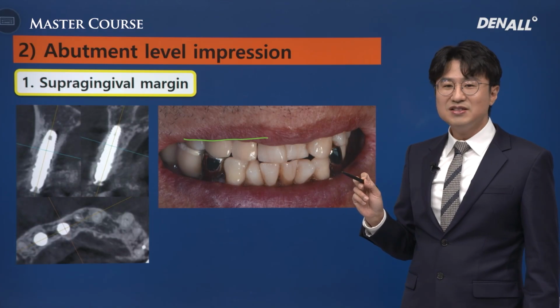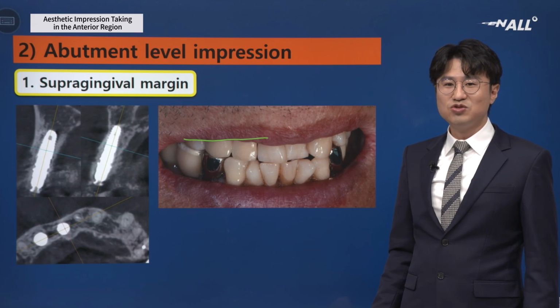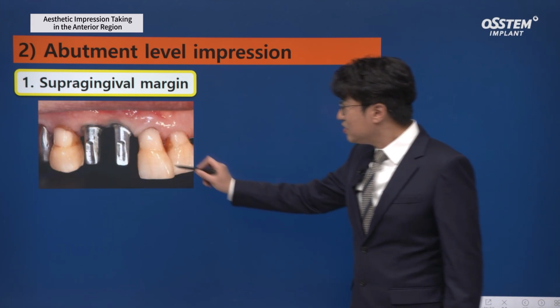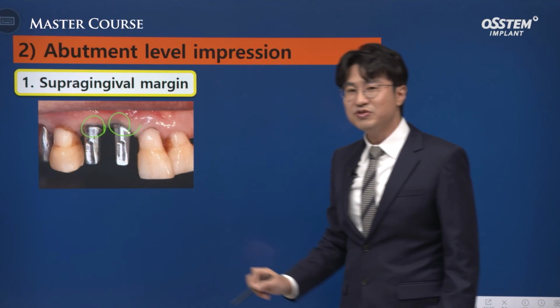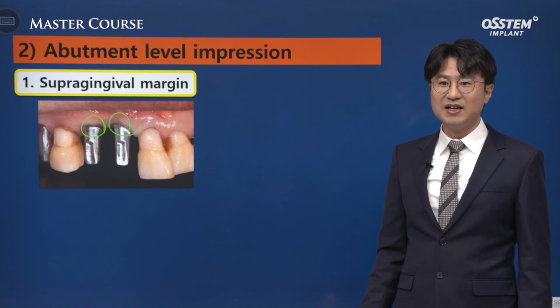We need to take caution for visible part aesthetics. For an invisible part, health should be given higher priority than aesthetics. You can see it is a supragingival margin because of the smile line that is covering the area.